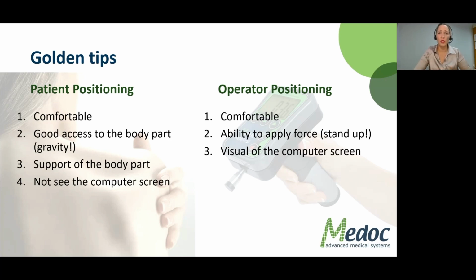Okay, so up to now, we talked about what pressure algometry is, what the AlgoMed does, and some golden tips about performing the test.